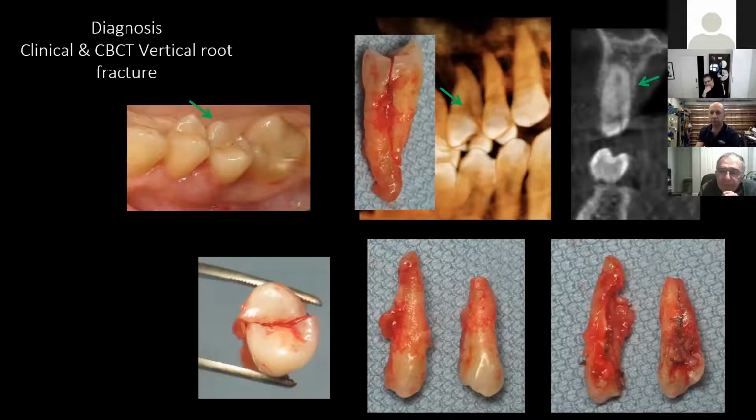That's right, that's exactly what we did. We went round and improved the occlusal loading and redistributed loading on the rest of the teeth. Then we allowed things to heal and proceeded with an implant placement for this particular patient, and the patient completely understood. The trouble is that we sometimes don't see the patient after a long time, and we don't know what happens to the work we do.